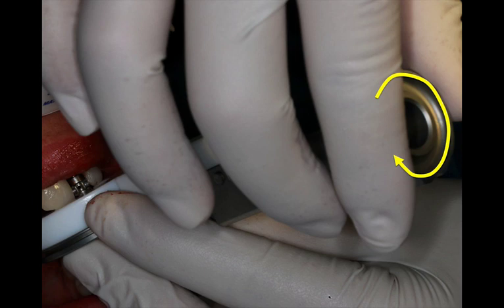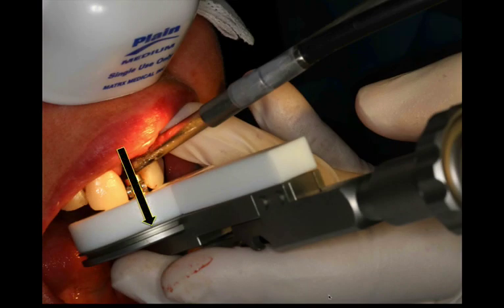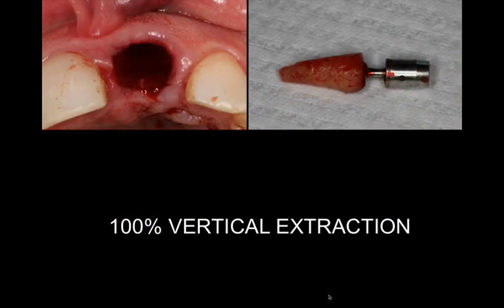You have to have a little bit of patience. Do this a few times — probably two or three — and the PDL fibers will develop significant inflammation and at some point they will tear. At that point, as you turn clockwise again, the tooth will be pulled in a vertical direction and removed out of its socket. Sometimes you hear a little click — I look at it as opening a bottle of champagne. This system allows you to remove a root tip in a 100% vertical direction, creating a beautiful extraction socket with no damage to the bone or soft tissues.